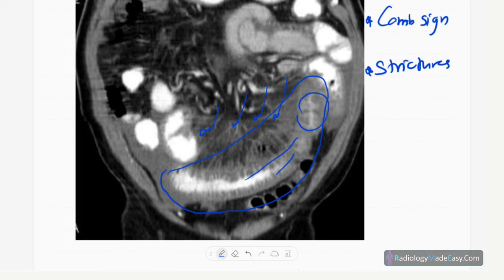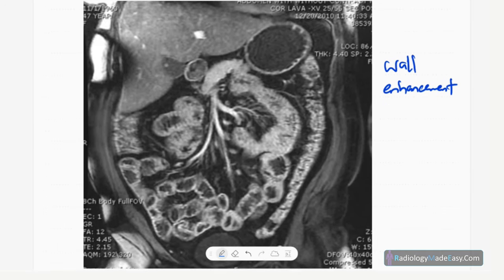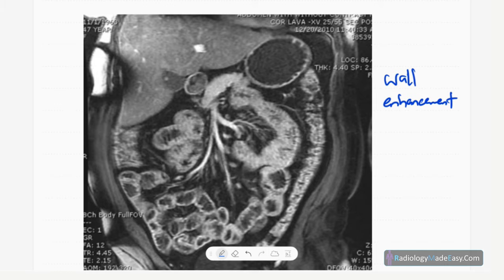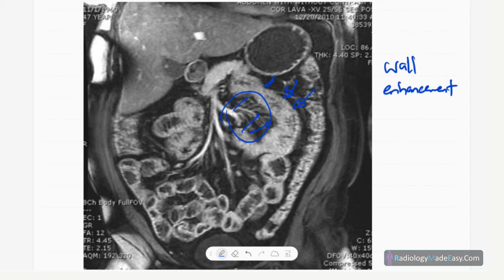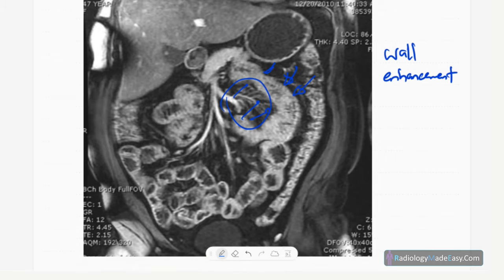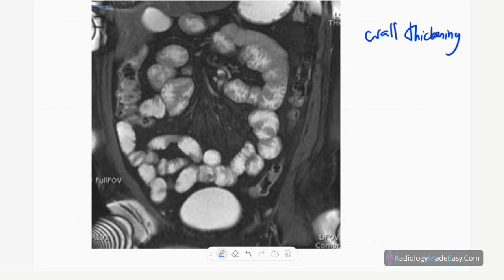Now let's look at MRI enterography. This is a contrast coronal image of the bowel showing thickening of the jejunal loops with enhancement and some venous congestion — wall enhancement, wall thickening, and venous congestion in the proximal jejunum. This is an example of Crohn's disease. In a non-contrast enterography image, wall thickening in the jejunum with skip lesions is also demonstrated — another example of Crohn's disease.